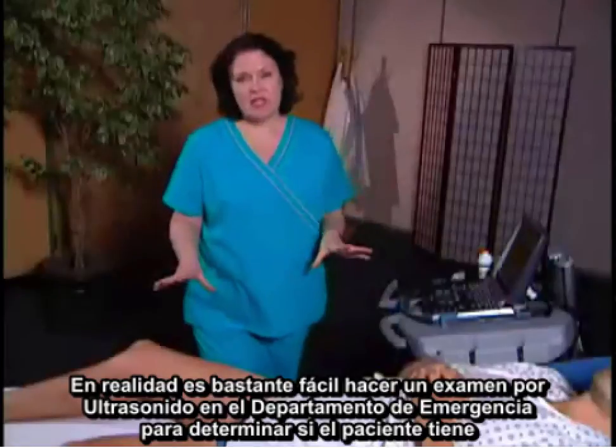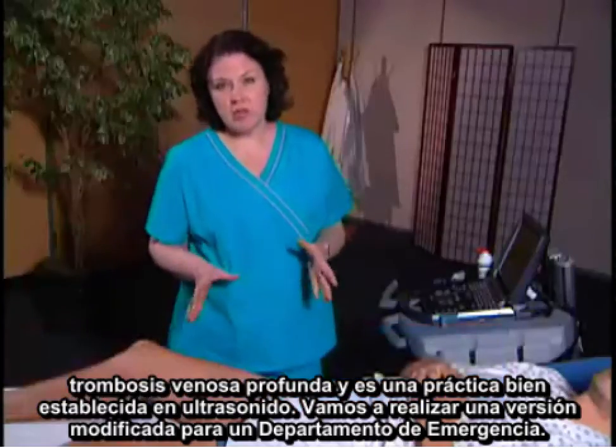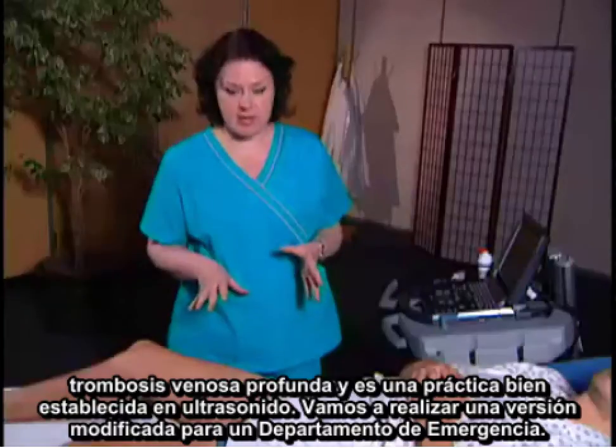So it's actually quite easy to do an ultrasound examination in the ED to determine if a patient has deep vein thrombosis, and this is a well-established practice of ultrasound. We're going to do a modified version of that for the ED exam though.